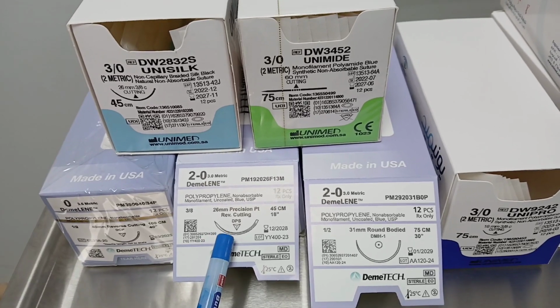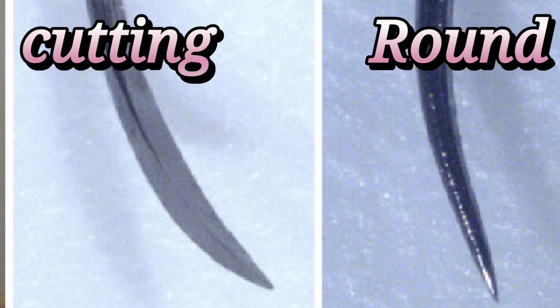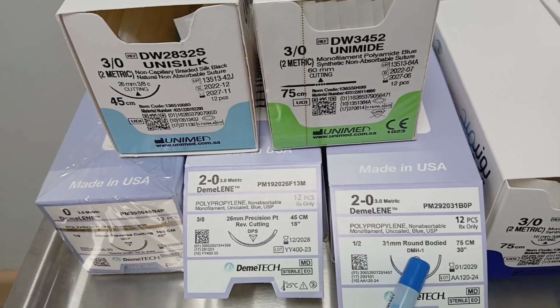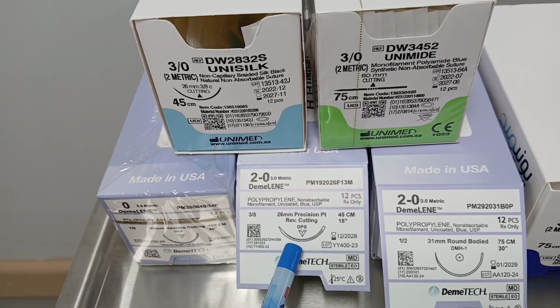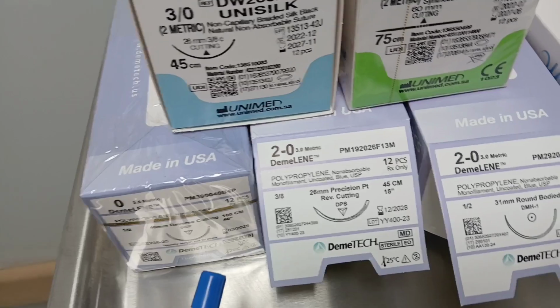Otherwise we can see the picture. Here you can see the difference, the needles are different. That is the round: if the tip comes like round, that is the round body. If the edge comes flat, that means cutting. So like that we have to differentiate, and we have to see the size. This one is a 26 needle. This one is a 31 needle. That also we have to observe, because some doctors particularly mention that only this much is needed for suturing. That also we have to observe clearly.